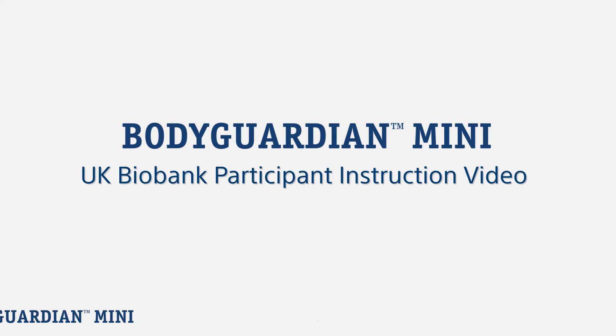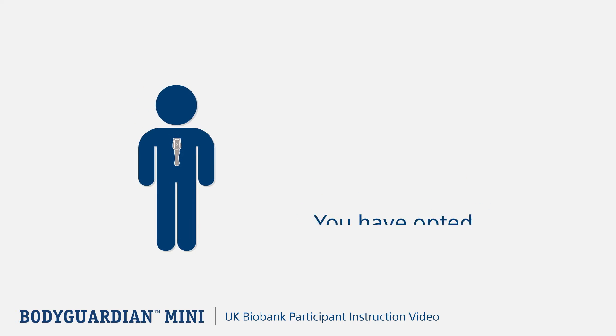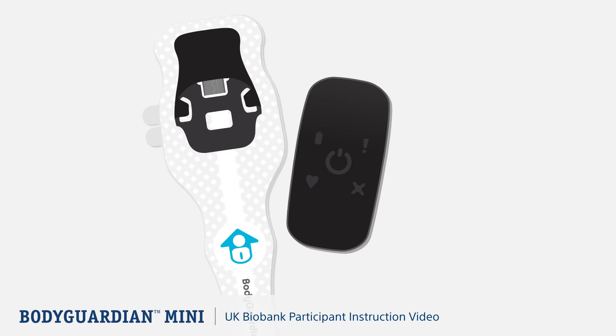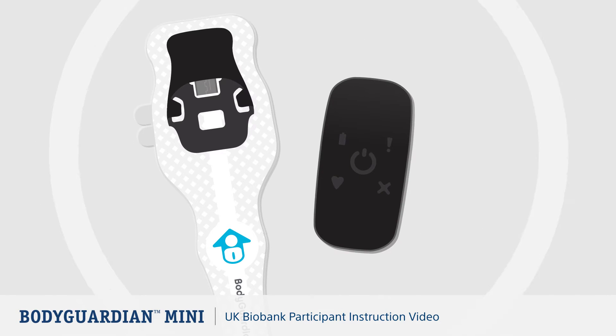Welcome to the UK Biobank Cardiac Monitoring Study. You've opted to participate in UK Biobank's Cardiac Monitoring Study. This video will walk you through the process of setting up your monitor and tell you more about what to expect during the monitoring study.